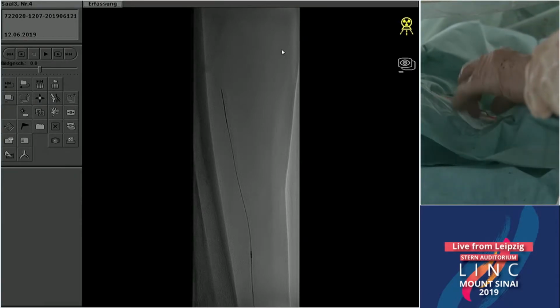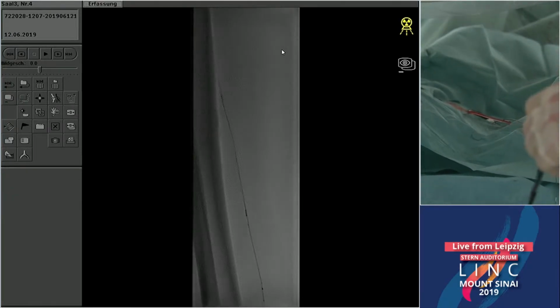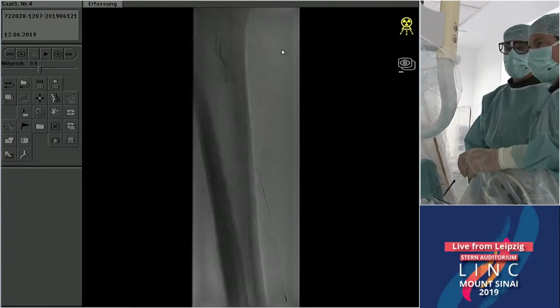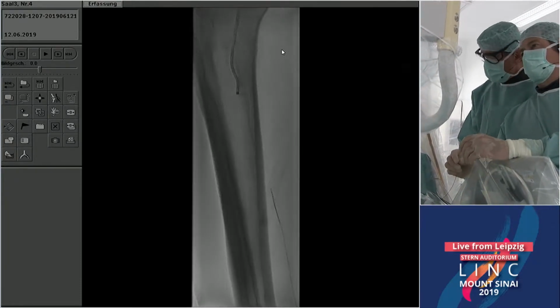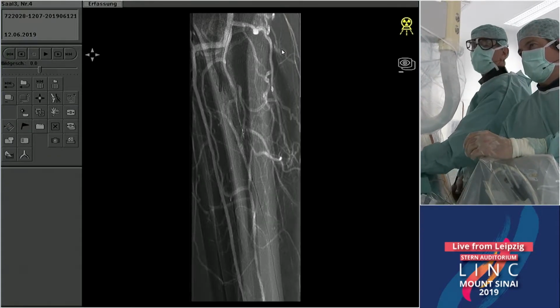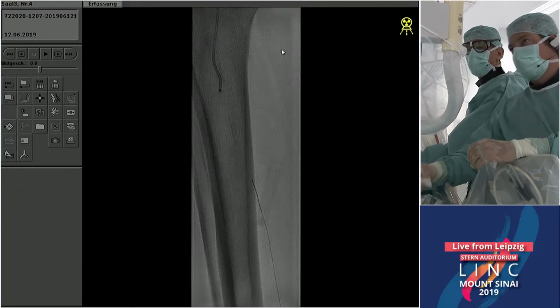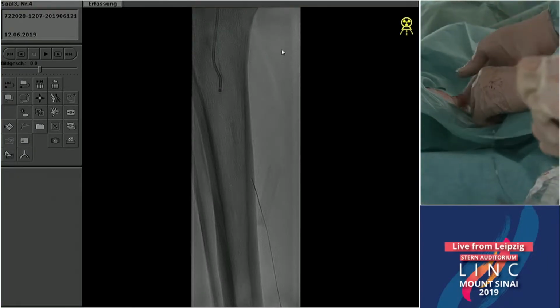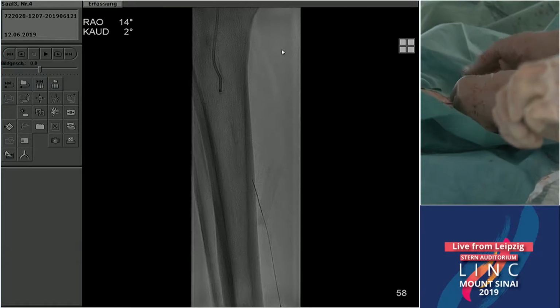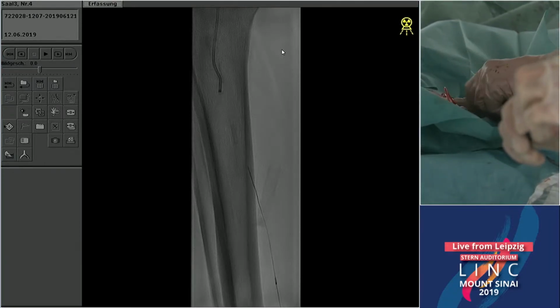Yeah, it's the old PT2 guide wire. Of course, once this fades, we may take another one, but this is still our workhorse to start with. Not necessarily nitinol wires, but just these low tip load 014 wires. Yeah, not 018 to start with.